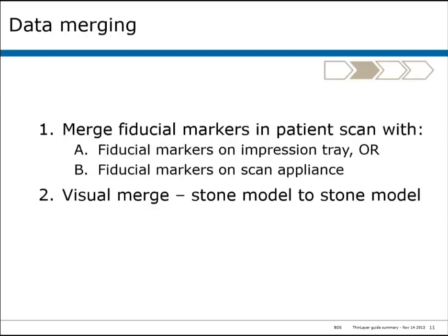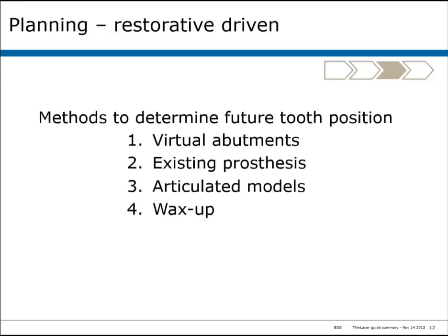Once acquired, the data has to be merged. The patient scan and the stone model scans can be merged on the basis of the fiducial markers on the impression tray or on the scan appliance. We merge multiple sets of stone models by doing visual merges of stone model to stone model.